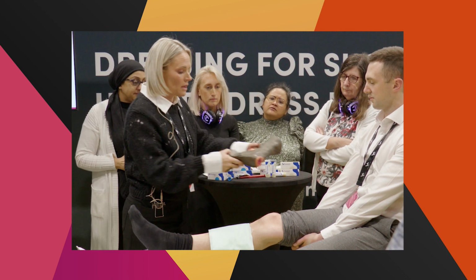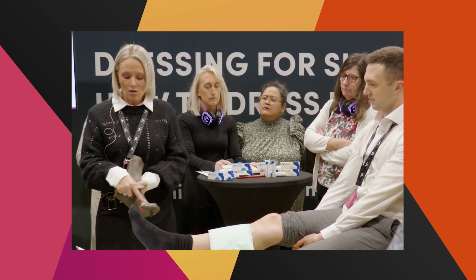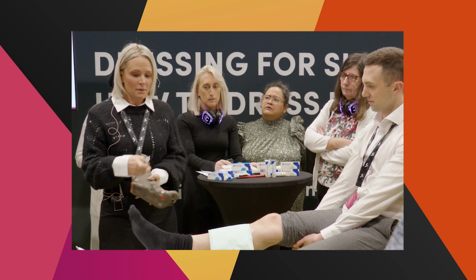Let's say we were doing a diabetic foot, which has got visible tendons or ligaments.